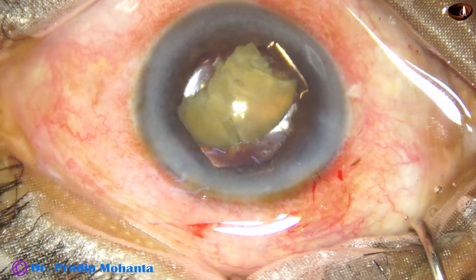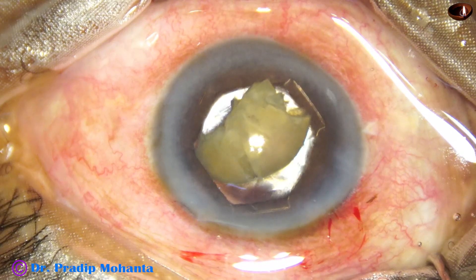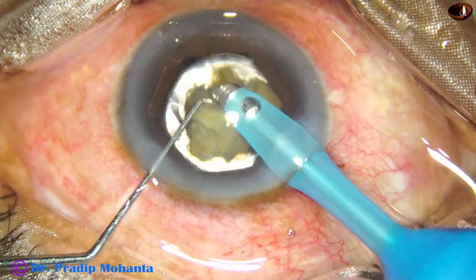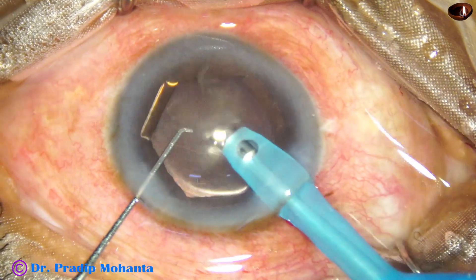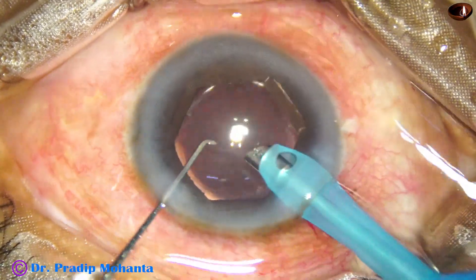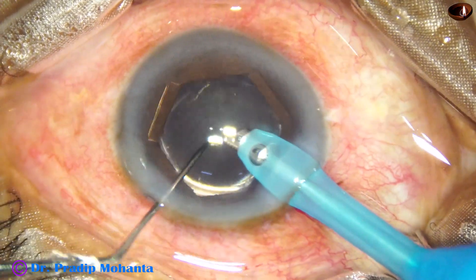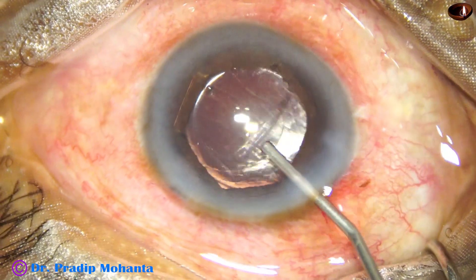Now I place the fragment over the lens and go into the anterior chamber to manage this fragment. I have to take care not to touch the lens and to be away from the cornea, so I remain at the iris plane and emulsify this fragment. In hypermature morgagnian cataract, it is a dictum to always use the IOL scaffold technique for the last fragment — know when to stop and emulsify that last piece after implanting the intraocular lens.